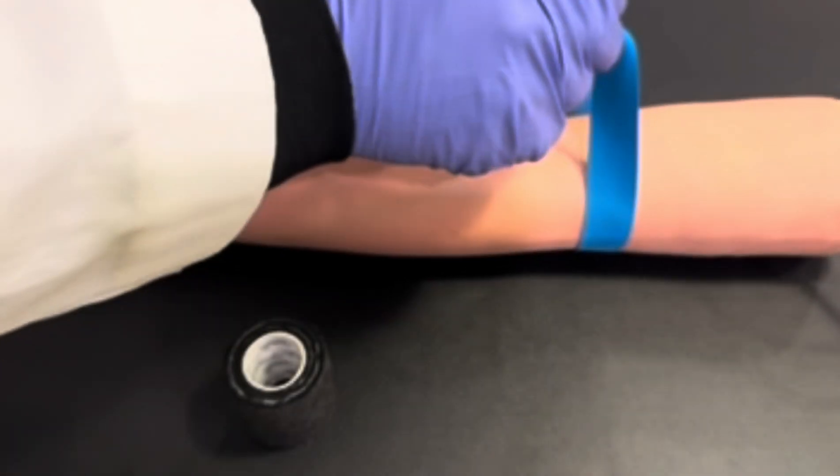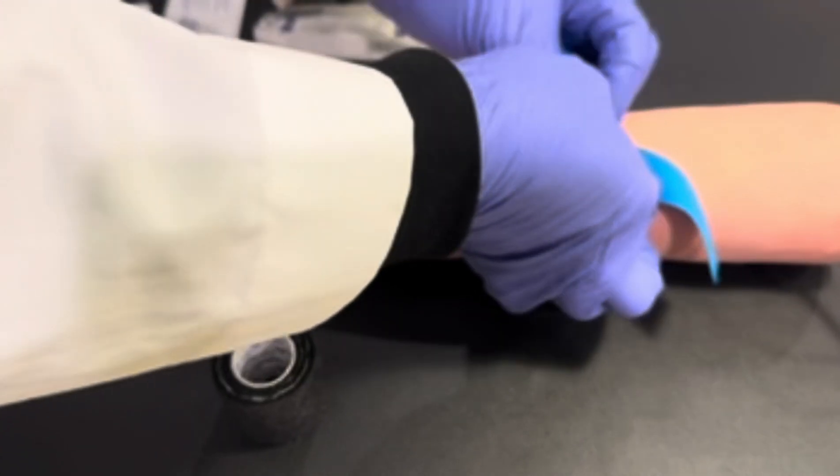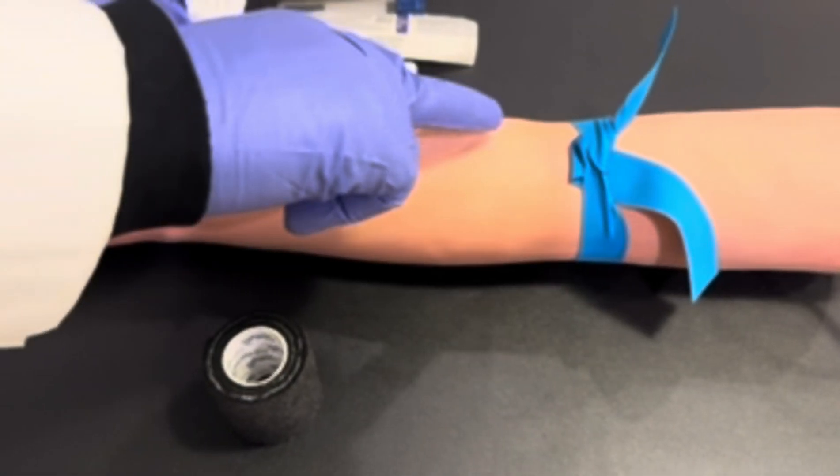Welcome back to another segment of Mastering Phlebotomy. Today we're going to perform a venipuncture using a butterfly syringe method.